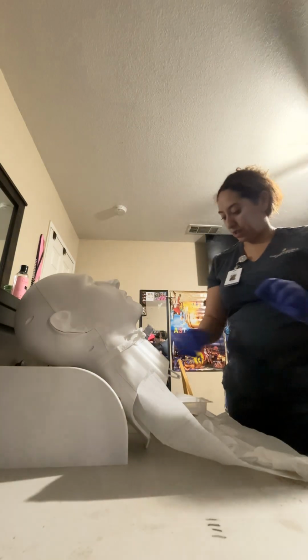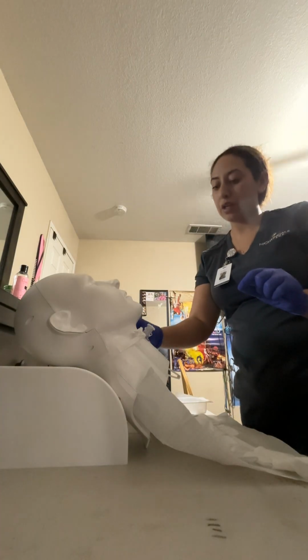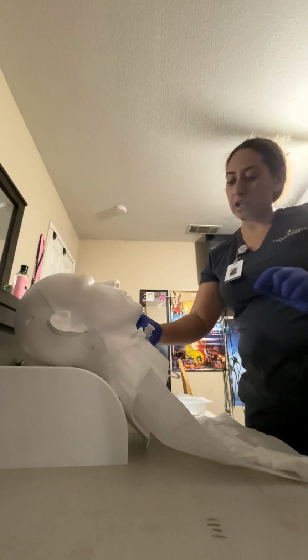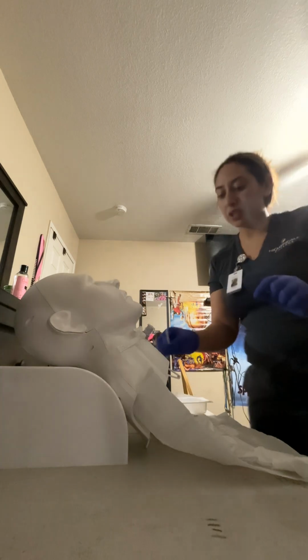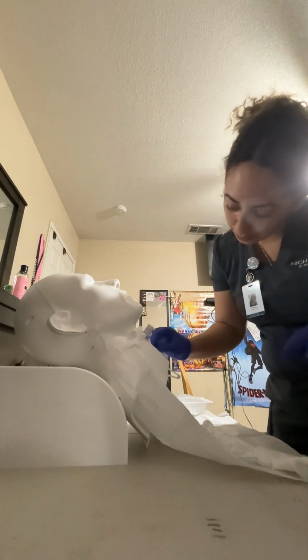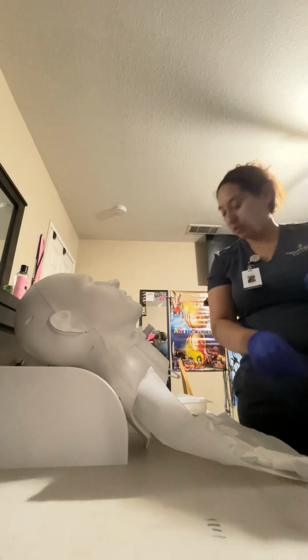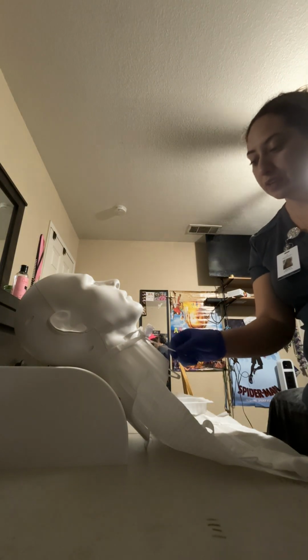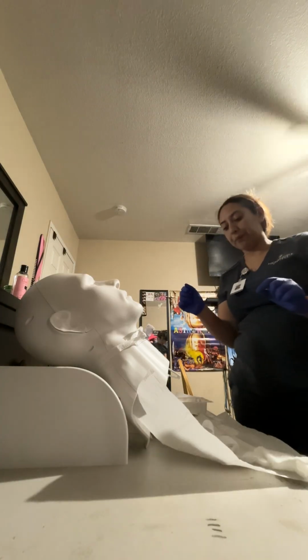and I'm going to toss it. I'm going to grab a new one. I'm going to clean around his stoma, around and out, and into the trash. I'm going to clean under the stoma site, lower neck here, and toss. And I have one more. We will clean around here. Here's the right side of his stoma, around and out, and we're gonna toss that.